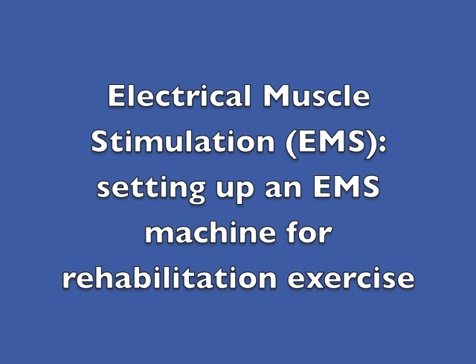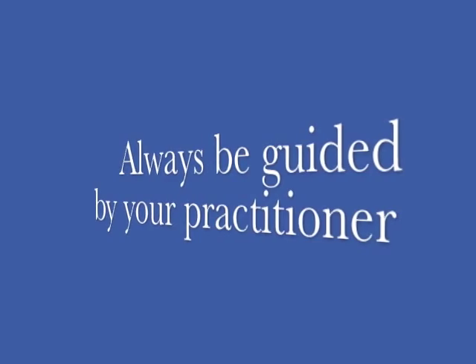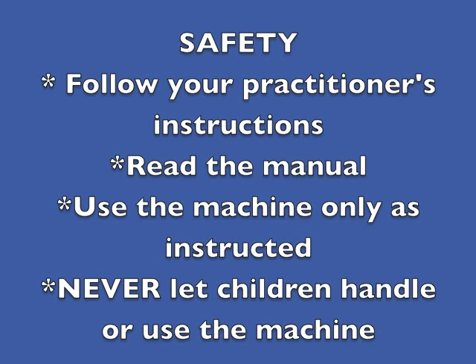This video shows how to set up an electrical muscle stimulator for rehabilitation exercise purposes. It's not intended to replace professional advice. You must always be guided by your practitioner. Use the machine only as intended and according to instructions.